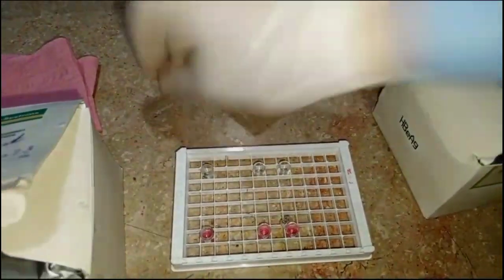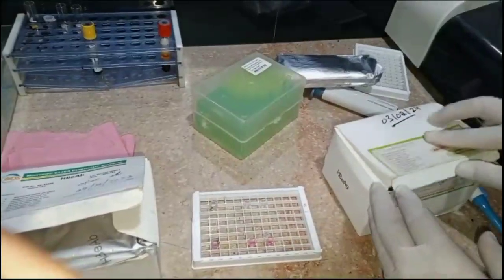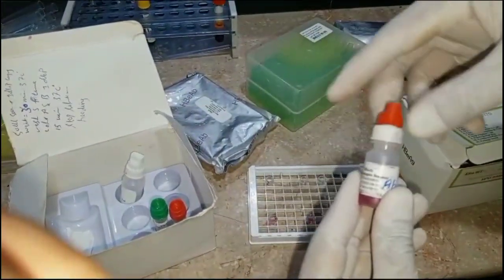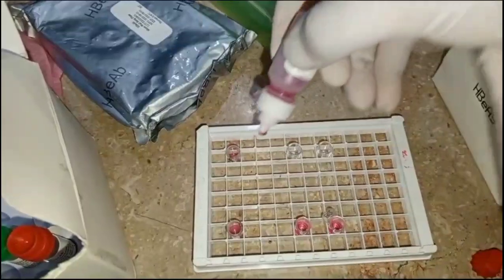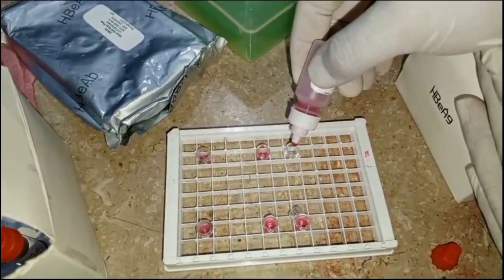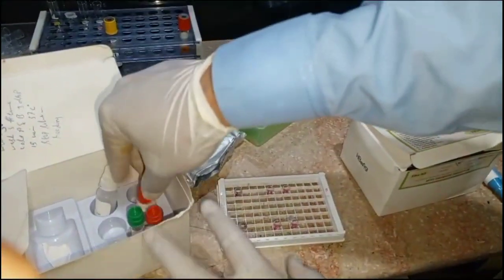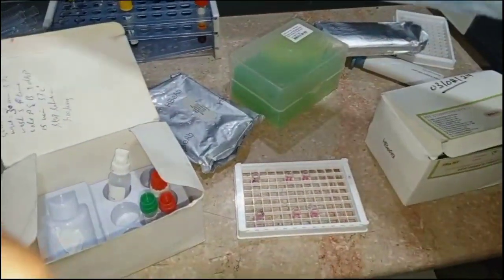Now this conjugate that we have added in each of the wells contains an enzyme which we call HRP. HRP means horseradish peroxidase. This enzyme is used to provide the color. This conjugate is also used to combine the antigen and antibody complex.